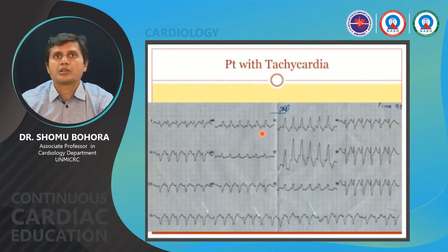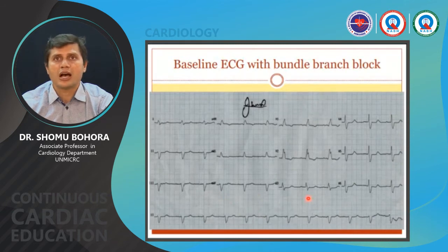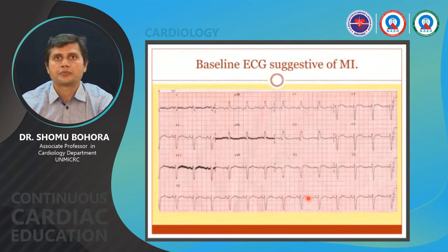This patient who presented with broad complex tachycardia, RBBB with left axis, was being diagnosed as a ventricular arrhythmia, but if you see the rhythm strip here, you can see it is irregular in nature, and if you see the prior ECG, it is similar, RBBB left axis, suggesting this to be an SVT with aberrancy. So if you have a baseline ECG, it helps.